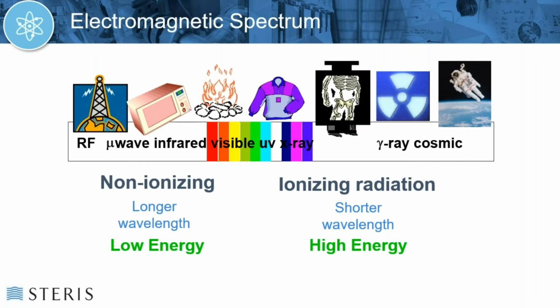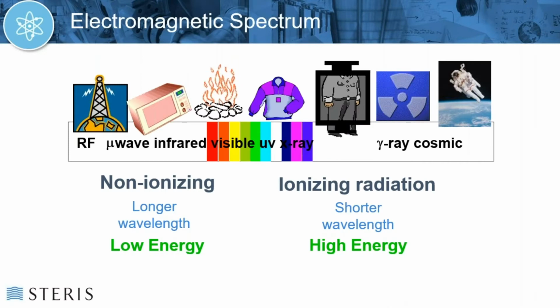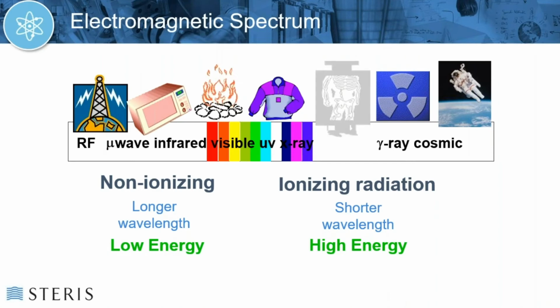Electromagnetic radiation can be further divided into ionizing and non-ionizing radiation. Anything below the UV spectrum is non-ionizing, whereas gamma, X-ray, and high ultraviolet light are ionizing radiation. Ionizing radiation has enough energy to detach electrons from atoms or molecules in the matter through which they pass, thereby ionizing the atom, causing some type of chemical reaction, such as in the molecules within the cells of our body.